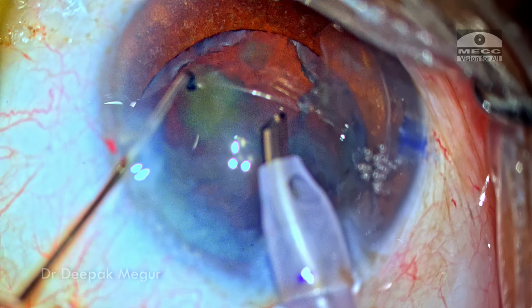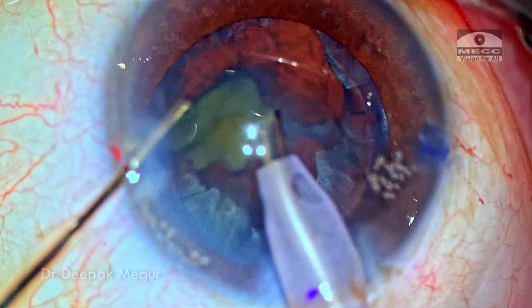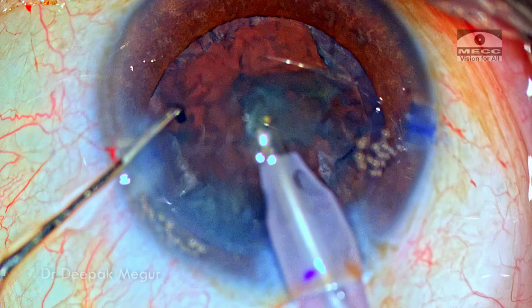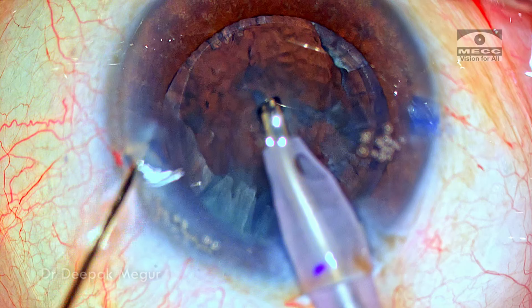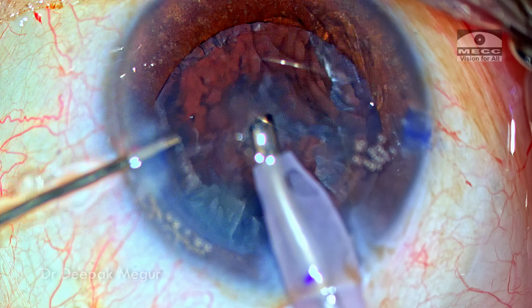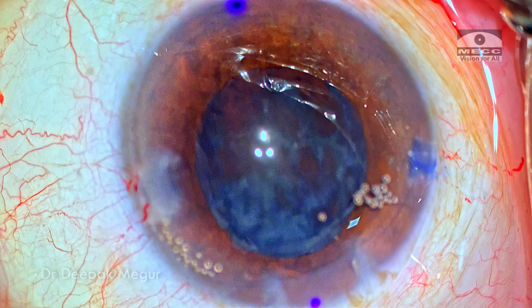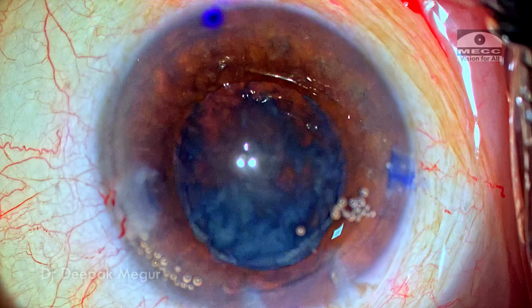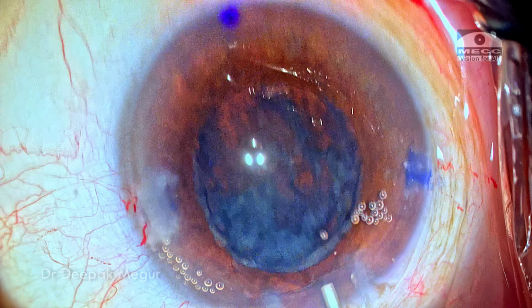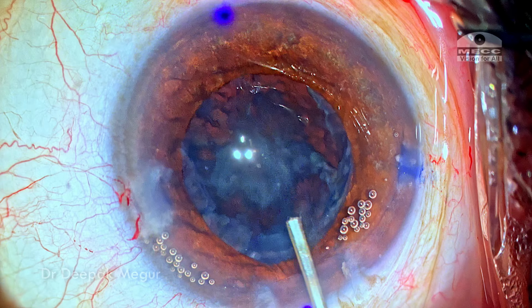Now we're left with a sheet of epinucleus and cortex, and the epinucleus does not look to be very thick. The last fragment is emulsified, and before the handpiece is taken out, I'm going to inject a viscoelastic through the side port just to maintain the antechamber as the phaco probe is withdrawn. I need to remind myself that the risk of PC tear still exists while aspirating the cortex, because these capsules will be relatively thin and more vulnerable to rupture.